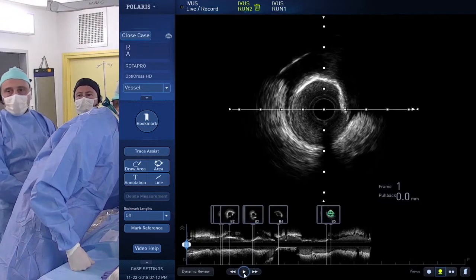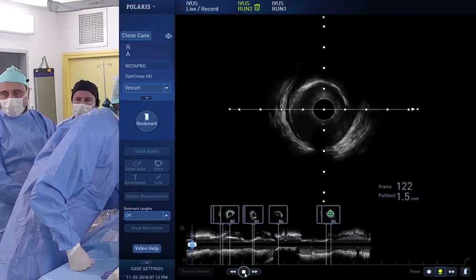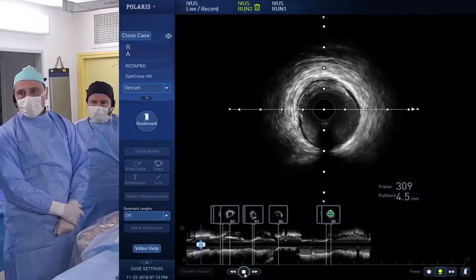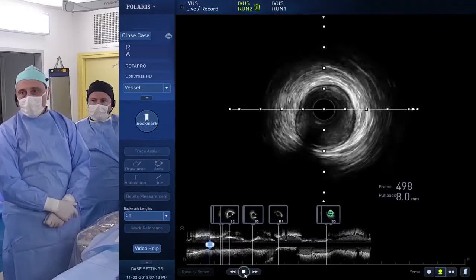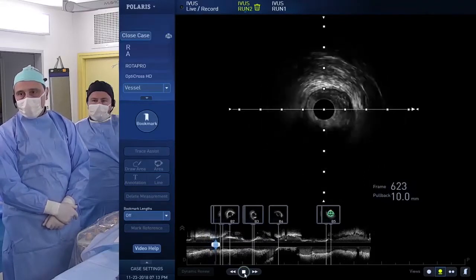Let's. Do you have the IVUS image? I guess so, yes. Yeah, the images are good, Emmanuel. So we are quite distal in this part. Maybe Emmanuel, you want to comment? Yeah, sure. That would be the so-called landing zone of our stent, which is perhaps the only segment free of disease, even though there is some plaque, as we have seen. Here we start to have some encroachment, but no major calcification.